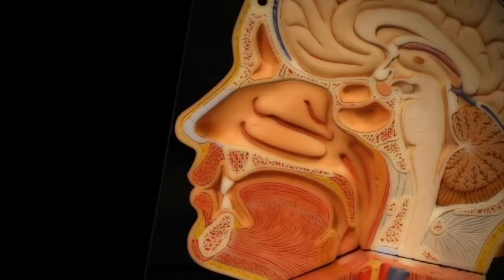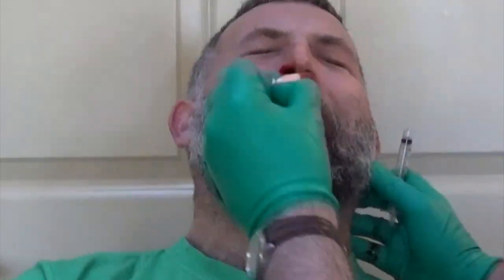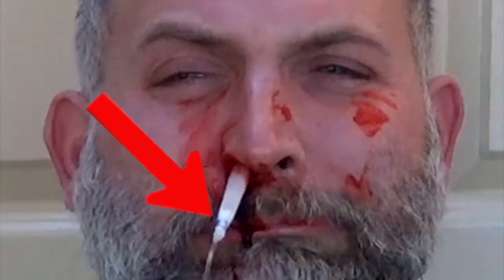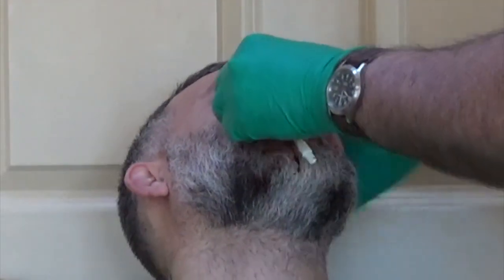Often we treat these immediately with prefabricated nasal packings, and they're effective, but they really hurt, and some patients just can't tolerate them, or the packing will migrate out of their nose, or the patient will vagal and pass out. You don't always have to start with this most painful, most aggressive method.